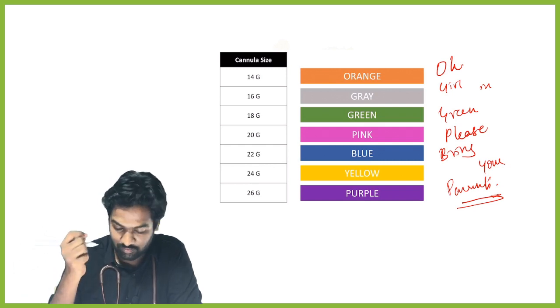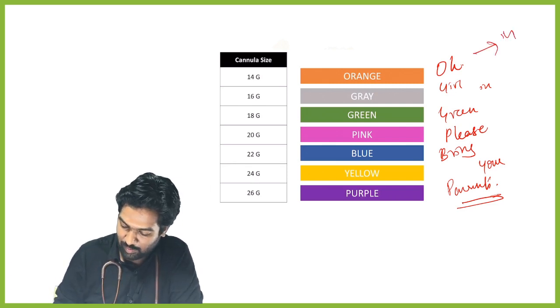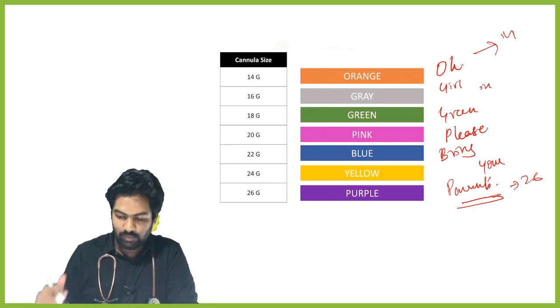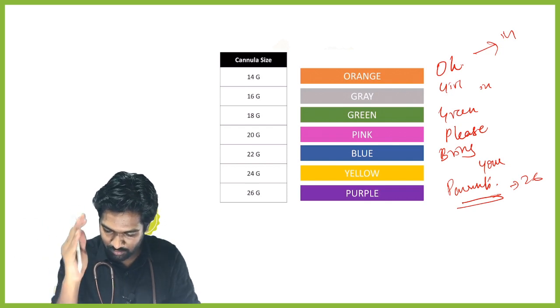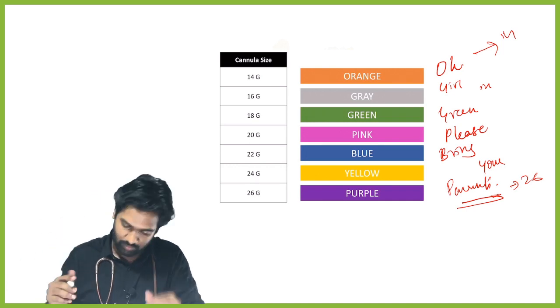If you just remember this, it is enough. But you have to know that orange is going to start, either remember orange or remember purple, that it is 26, and start reducing by 2 each, or start increasing by 2 each. Is the mnemonic legible there, guys? Oh girl in green, please bring your parents. Legible? You can see? Okay, fine.